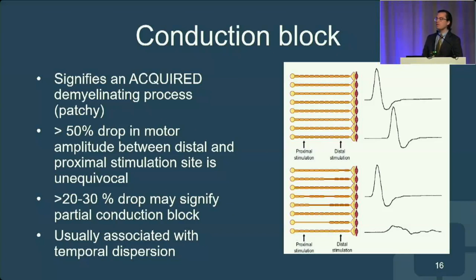A lot of times these findings, not only demyelinating findings, but also amplitude changes in somebody who has an axon loss process, do take some time to show up. And that's because after you've transected an axon, Wallerian degeneration isn't immediate. It does take some time to develop. So the common teaching is that with symptom onset, you should probably wait at least 3 weeks before doing nerve conduction studies, because if you're doing it before then, you may falsely conclude that there are some normal findings. So it does take a number of weeks for these findings to develop.